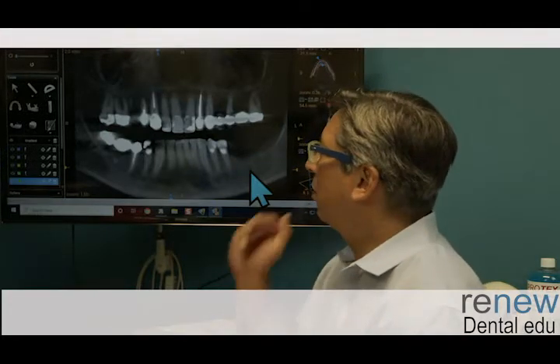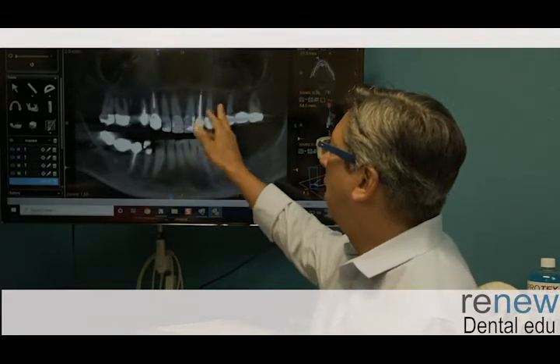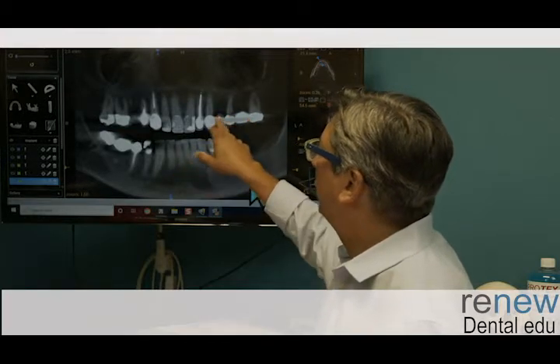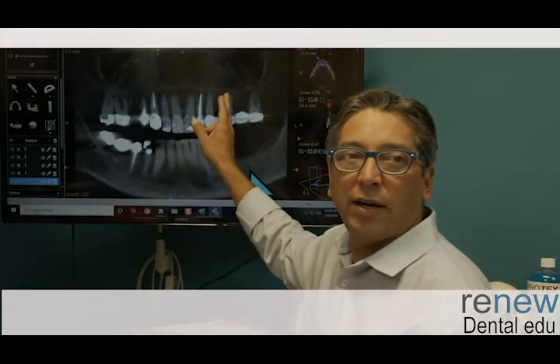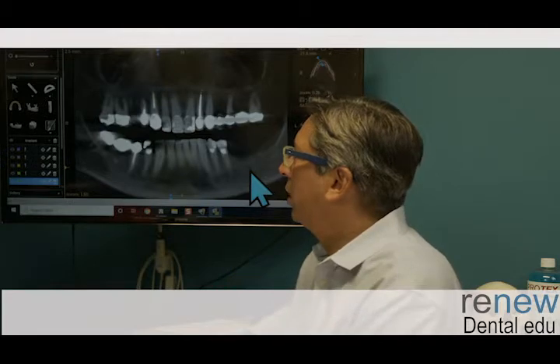This is definitely one of them where I disagree with what the doctor was thinking he can do or try, which was try to put a Bicon implant here, and this is also a failing 5-unit bridge with the pier abutment failing, and this needed to be cut off right in this whole section. And because of the weird sinus and the bone density, this was also not a good site, and implants had failed down here and up here. The other problem is you can see that there was an extraction here.